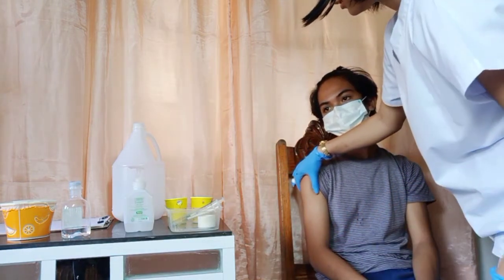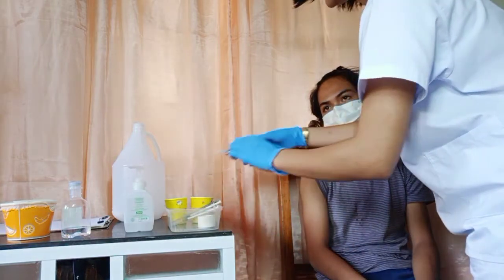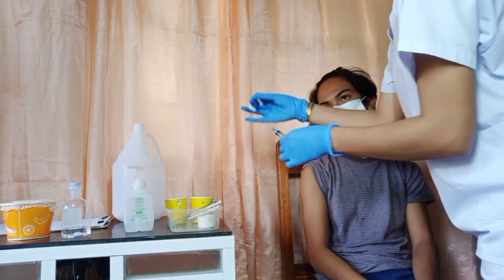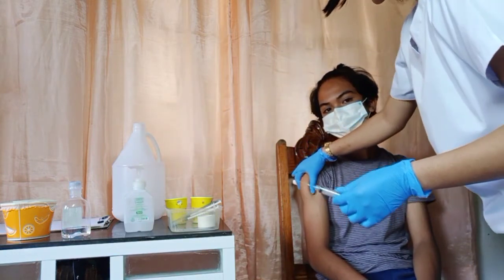And then open the cap without infecting the needle. Press the site.